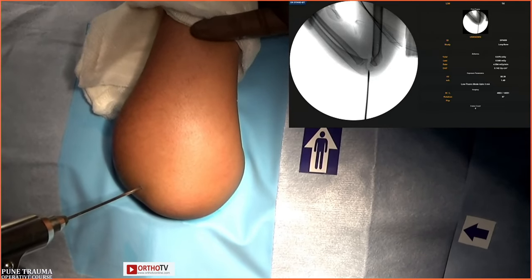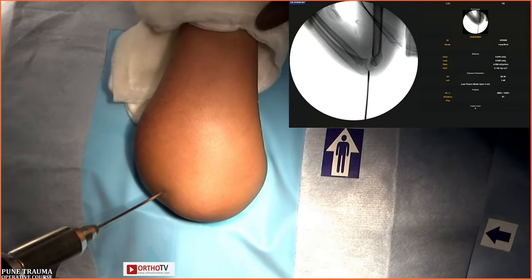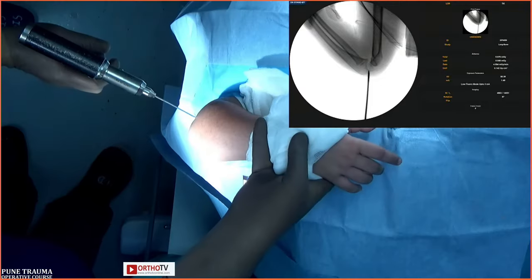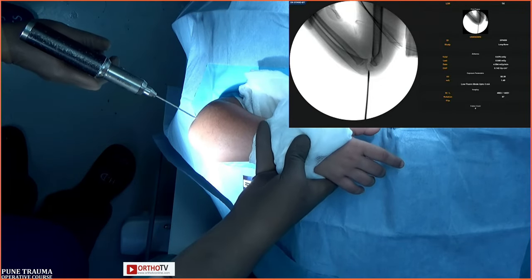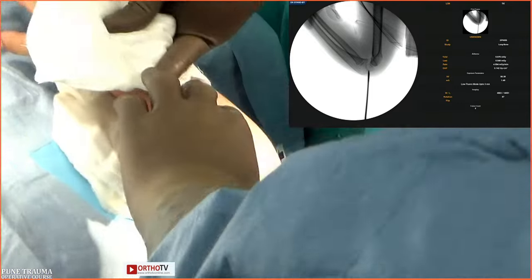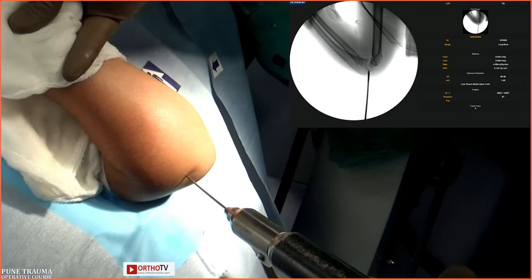One minute. And from the side, how does it look? What are the landmarks or how do you put it? Can you come this side? All of you can see his direction of the pin is going from anterior to posterior, because that's the direction of the distal humerus. You can see the C-arm picture also. So now I'm going to incline it along the teardrop, which is 40 degrees anterior, right, Tarak?